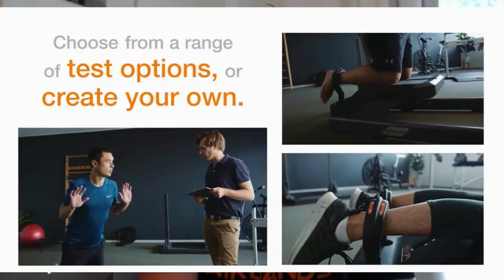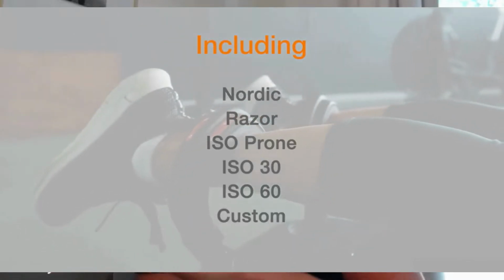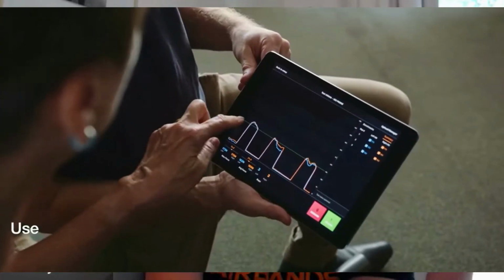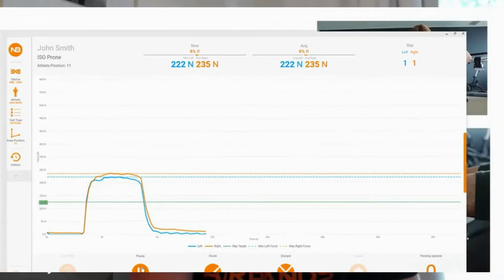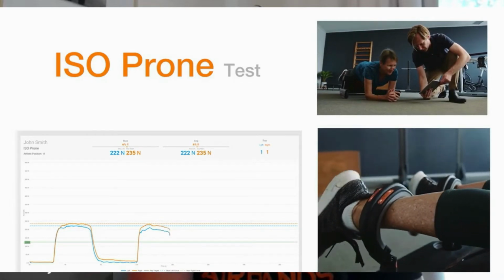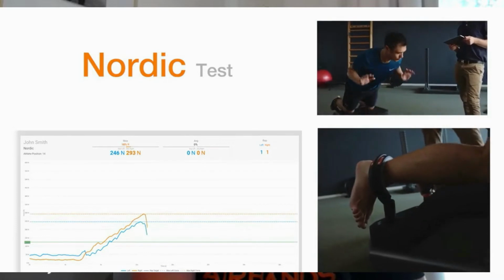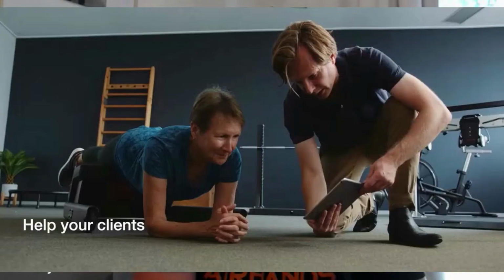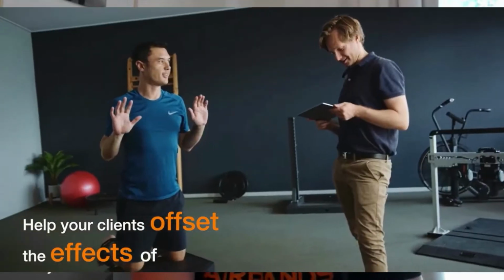You put a load cell, you know, on the Nordic hamstring curl, instead of someone holding onto the ankles. You put a load cell right there that's capturing how much strength, or how much load input, they're going through on each left and right side. And as you could probably imagine, soccer clubs, physio clinics, and performance clinics all across the globe really ate it up and really understood the significance of what an objective test, very quickly done, can provide.